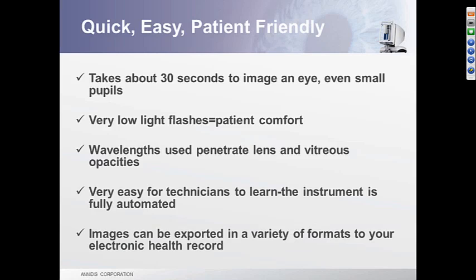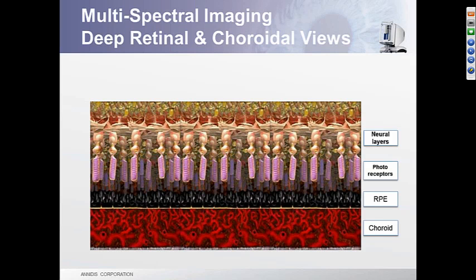As you all know, it's very quick. The light flashes are low light, and the wavelengths can actually penetrate quite nicely the lens and vitreous opacities. Very easy for technicians to learn, and images can be exported in a variety of formats. I know a lot of you have already spent some time sending images to me for interpretation and advice, and I would encourage you to continue to do that.